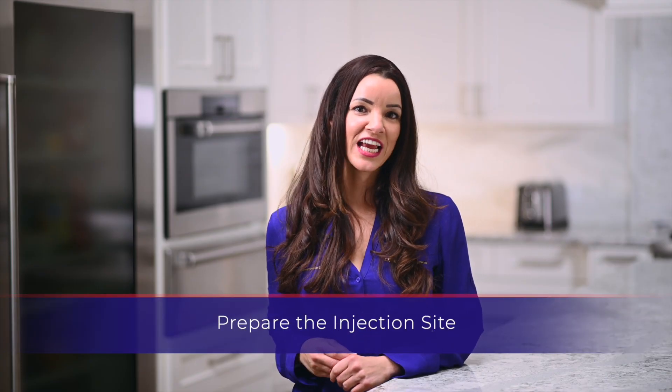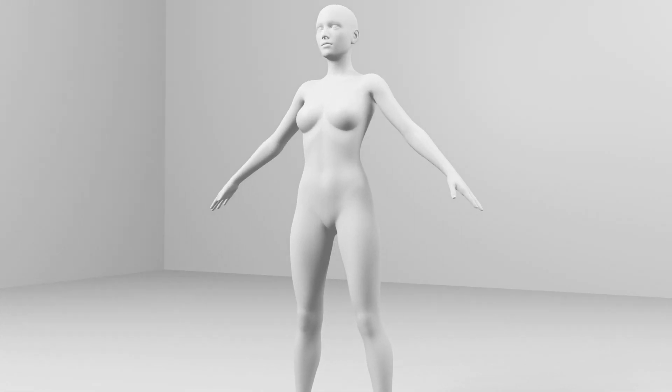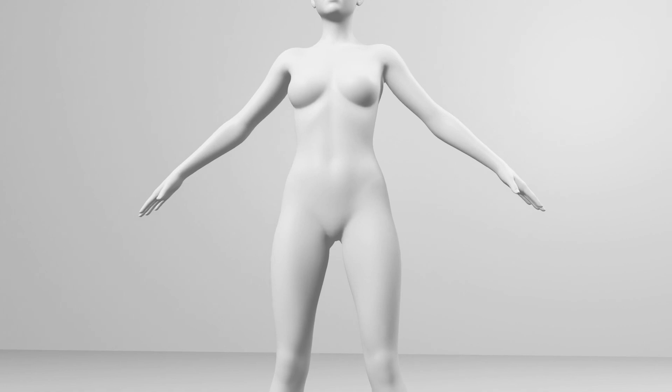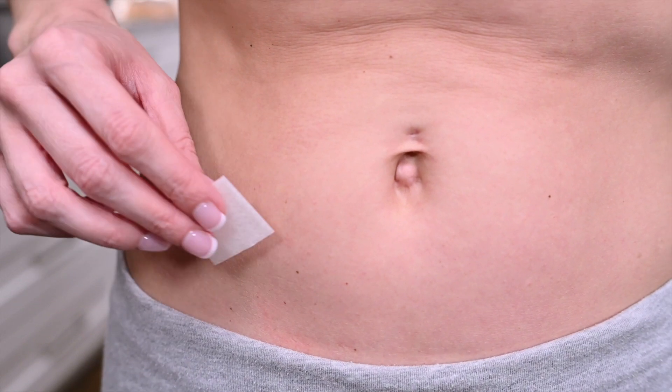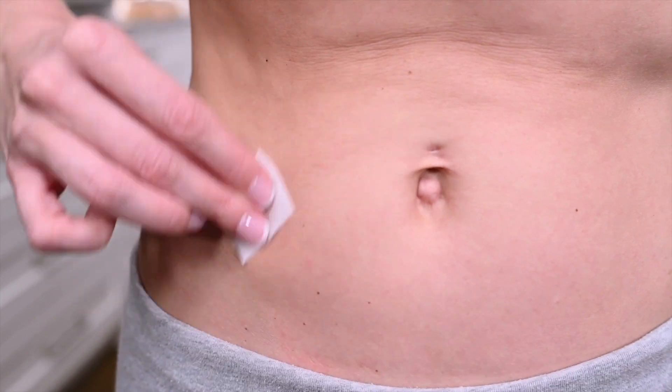The injection site will be a subcutaneous location that has been specified by your physician. The most convenient site for a subcutaneous injection is in the abdomen around the navel. Use the alcohol prep wipe to clean the injection site and allow the patch of skin to dry. You may choose to alternate injection sites as needed.